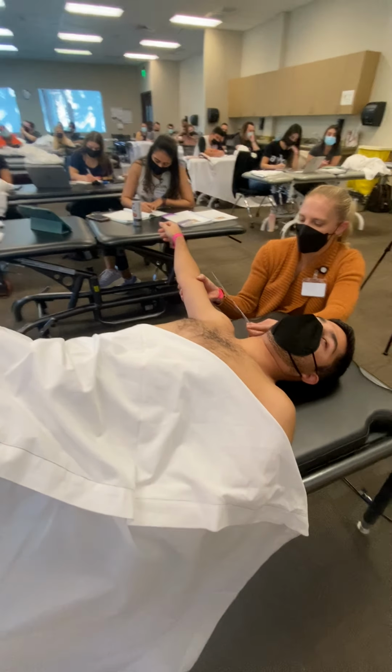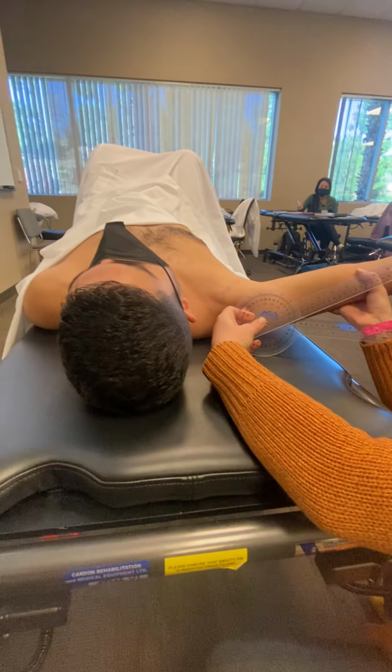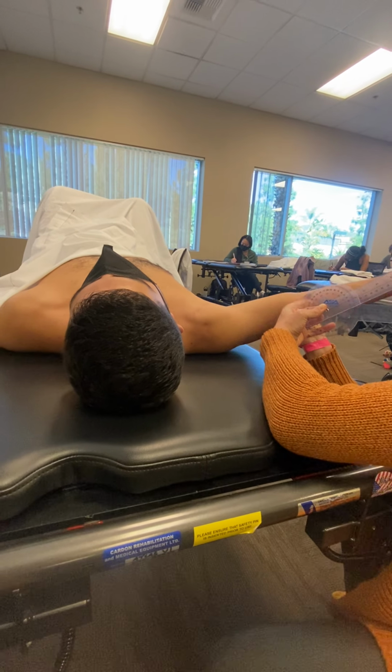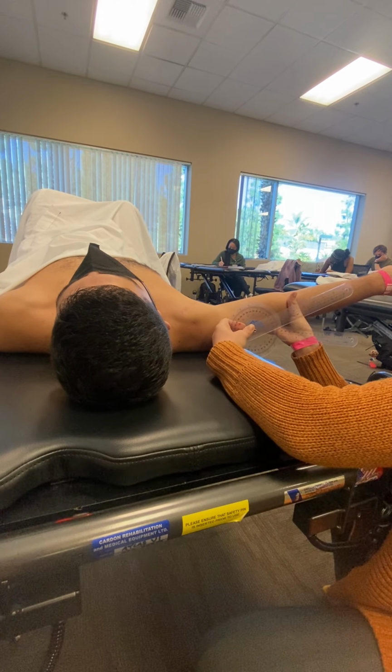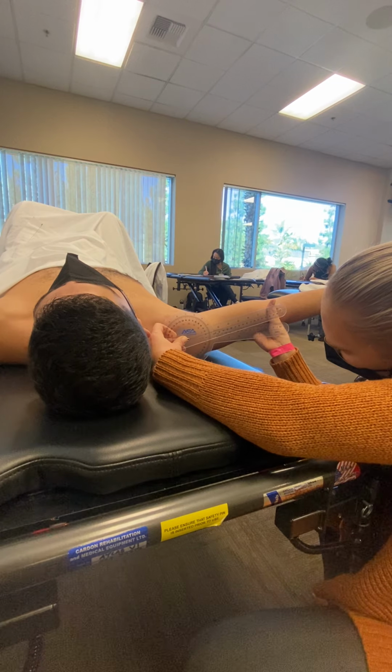So for this, if you're measuring, I don't even know if you can see with my big head, I'm very sorry. You're going to be measuring, the fulcrum is going to be at the acromion. Your moving arm is going to be towards that lateral epicondyle. Stabilizing arm is going to be parallel with the ground or the table, whichever way you want to think of it. And here he is 11 degrees from the table.